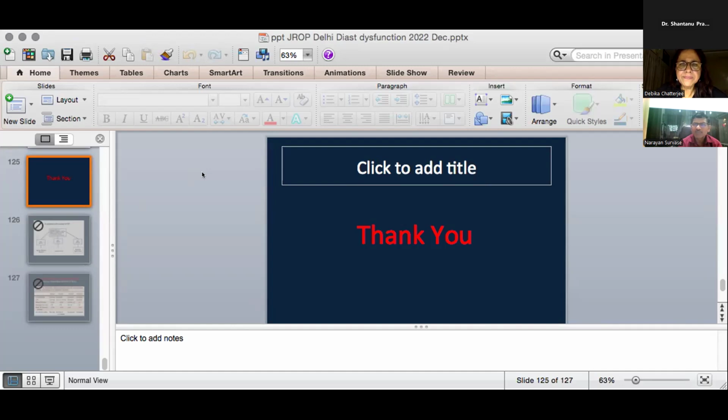Yes. Dr. Muzaffar, in today's 2025, we look at the 2016 guidelines: EA ratio, E prime septal, E prime lateral, average of E to E prime, LA volume index, and TR jet velocity, in normal LV systolic or abnormal LV systolic function. Now the question comes when you are uncertain, especially in abnormal, then you look for LA strain. These IVRT, flow propagation velocity are used in other conditions which are non-cardiac, like valvular disease, hypertension with hypertrophy, pulmonary artery hypertension. In those conditions, we switch over.